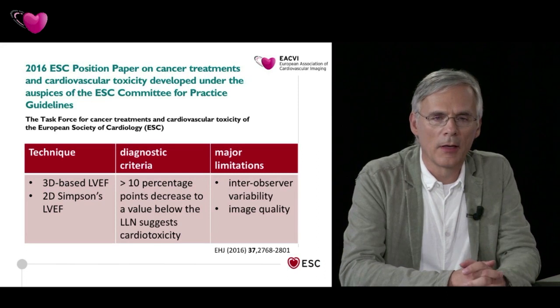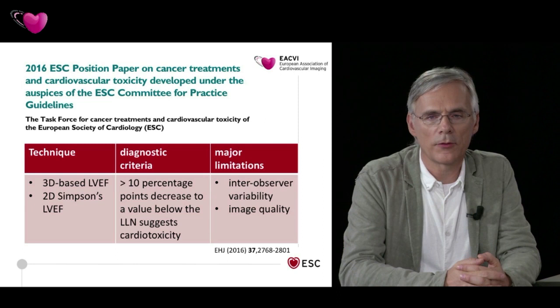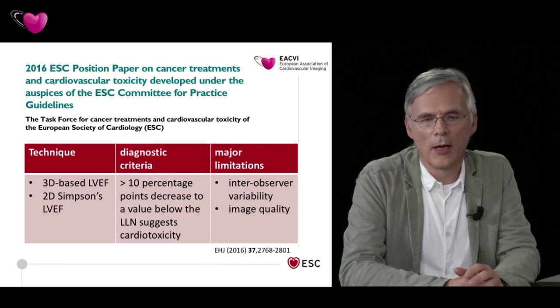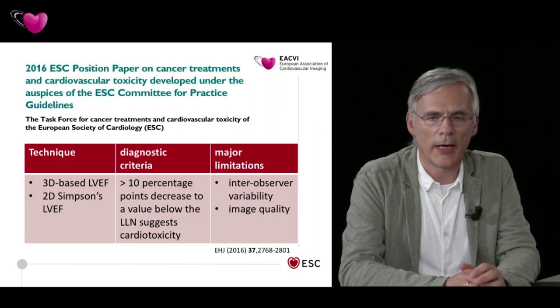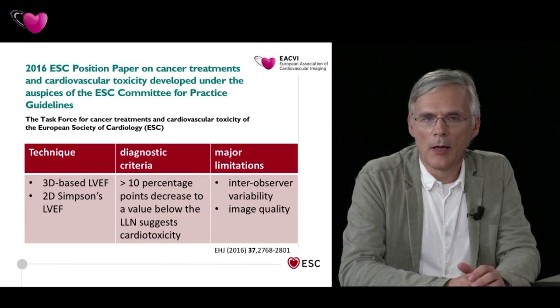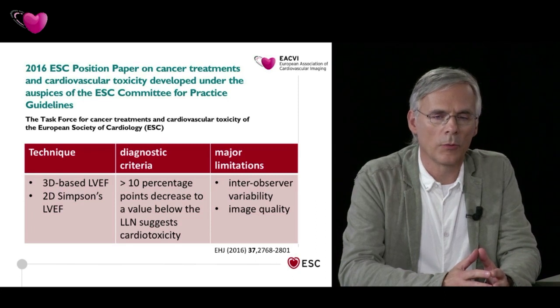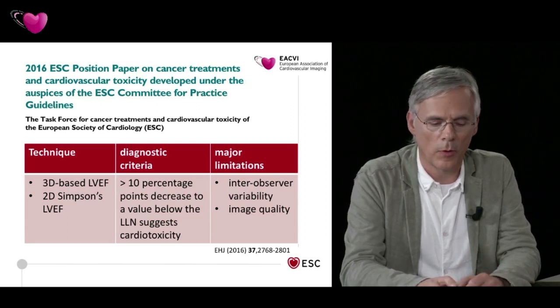If we look into the 2016 ESC position paper on cancer treatments, echocardiography is recommended as imaging modality of first choice. And the paper mentions two major limitations of echo: inter-observer variability and image quality. And we know from numerous studies that we can reduce inter-observer variability by contrast and improve image quality.